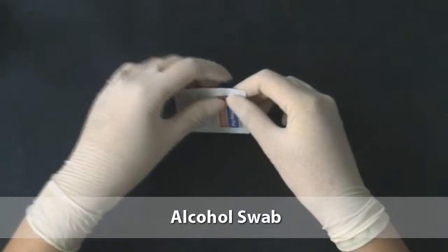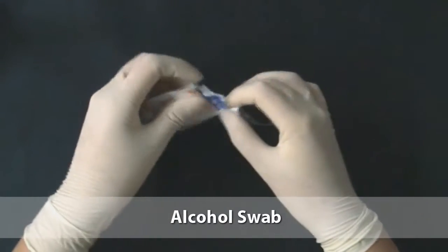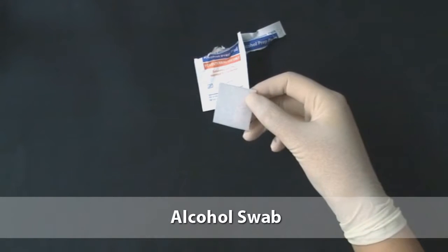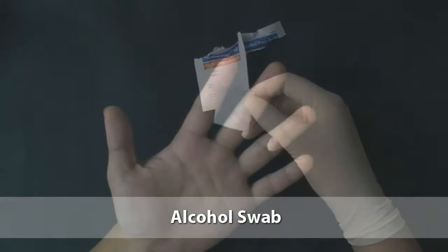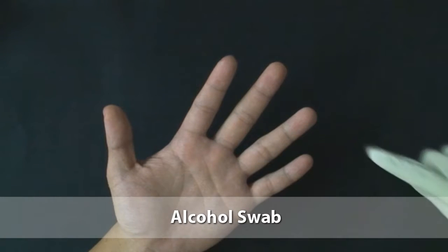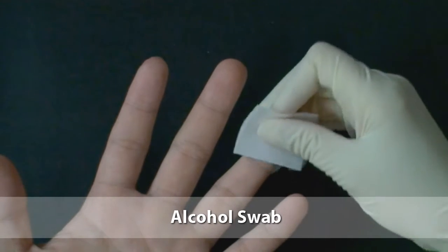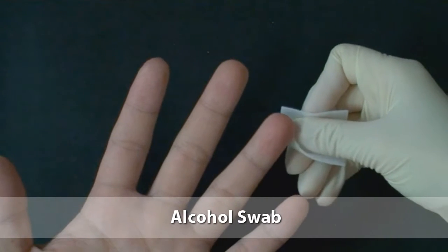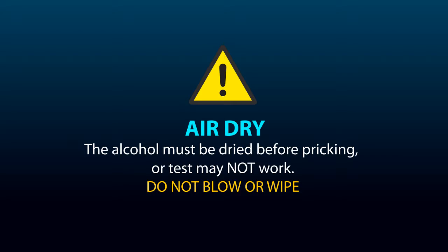Open the alcohol swab. Grasp the fourth finger of the patient's hand and clean the patient's finger thoroughly with the alcohol swab. After cleaning the finger, it must be allowed to air dry. Remember, the alcohol must be dry before pricking, or the test may not work. Do not blow or wipe the finger to dry it.